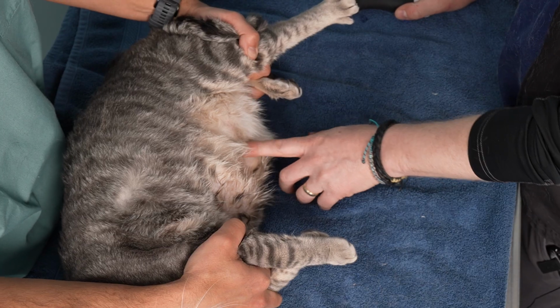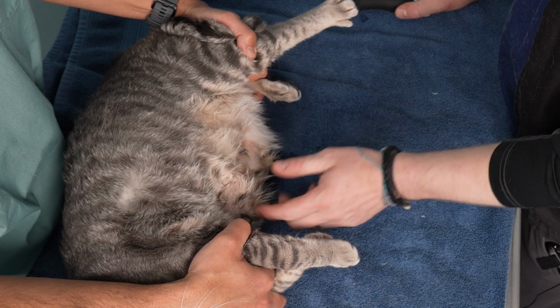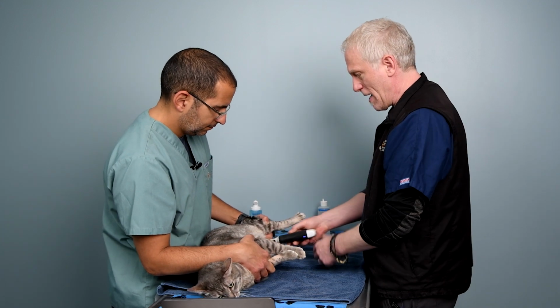How do we do that? You can either look for the actual umbilical site that we'll often see as a little scar in a lot of our patients, or if you can't find that, you'll sort of go halfway between the subxiphoid site and the urinary bladder. And we'll come in on long axis to start with.